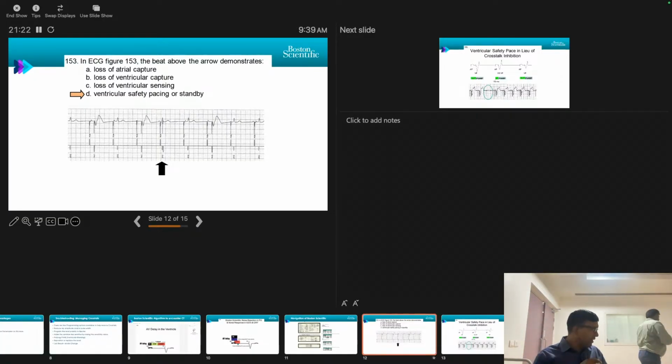I will summarize what he was saying, because the language was very technical. First of all, understand the basic requirements. When we have a pacemaker with two leads, one in the atrium and one in the ventricle, crosstalk means talking between the two chambers and the two leads.